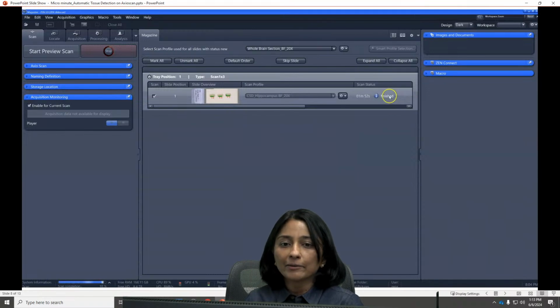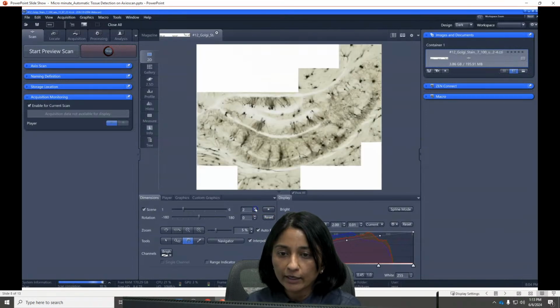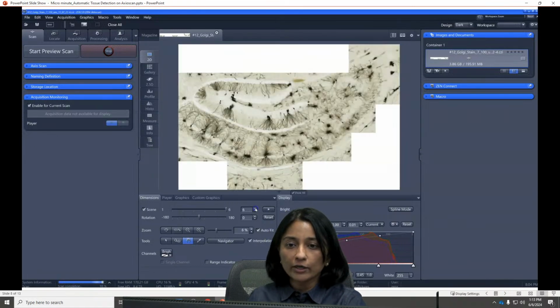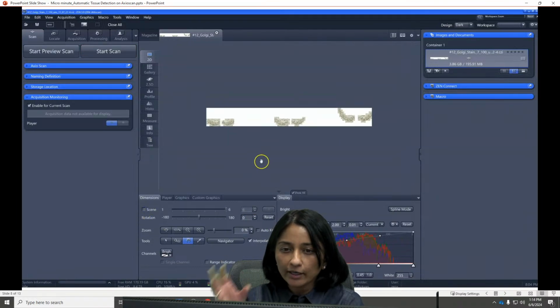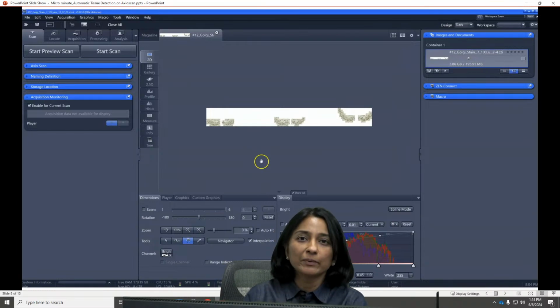So once the scan is completed, now you can go to viewing each of these individual sections that were detected, right? So each of the 6 scenes. And for me, just seeing individually each of those 6 scenes that were detected and scanned, that's seeing is believing, right?